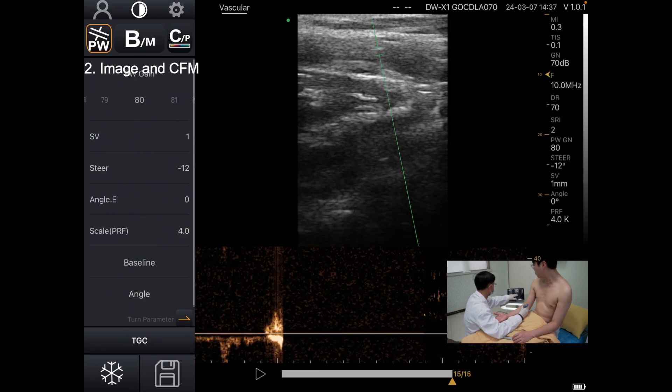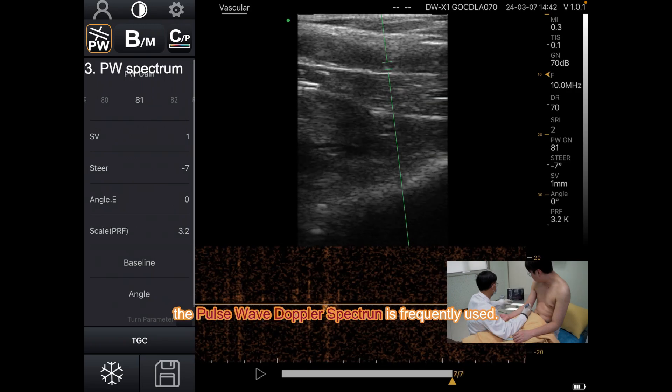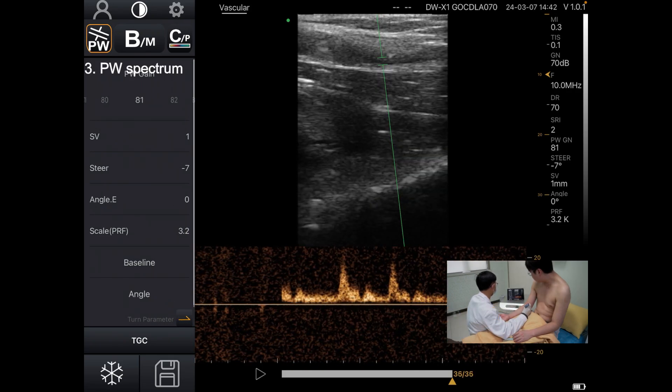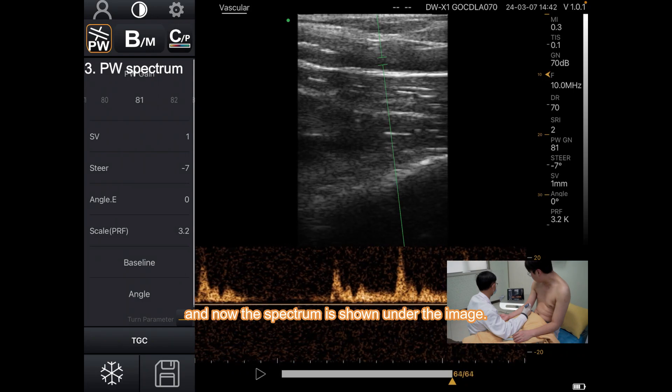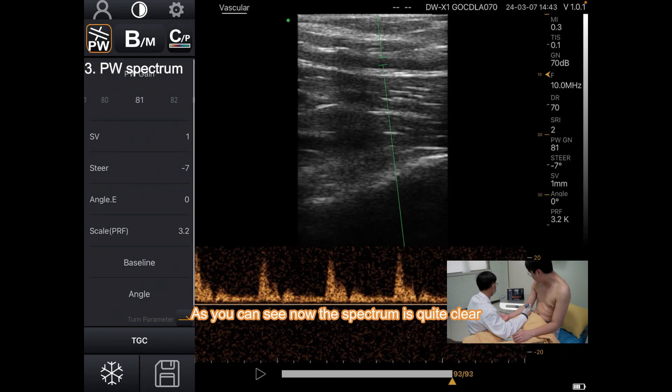Now the blood signature, and also the pulsed Doppler spectrum is frequently used. The spectrum is shown under the image, and as you can see, the spectrum is quite clear.